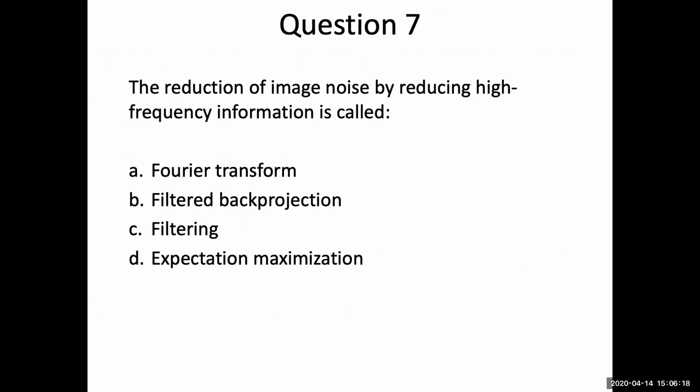Question. The reduction of image noise by reducing high frequency information is called, one answer here. Only one answer. There's another way to reduce the noise, to apply kind of what? Yes, correct. Filtering, like low pass filter, Gaussian filter, or whatever you have in your system.